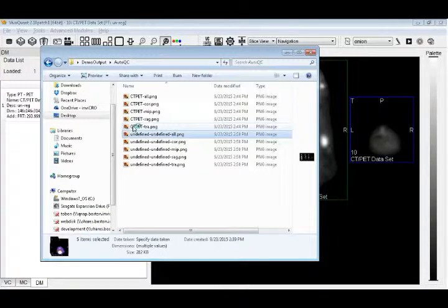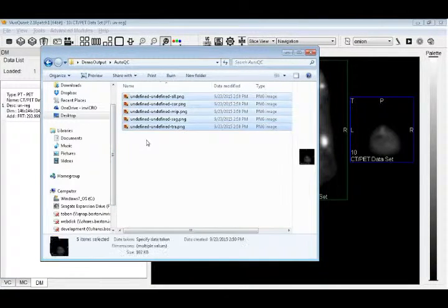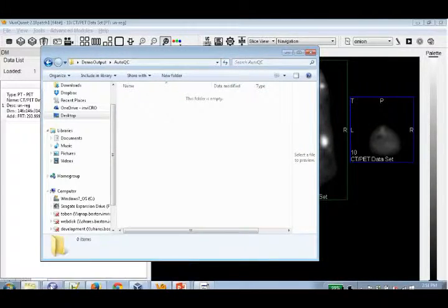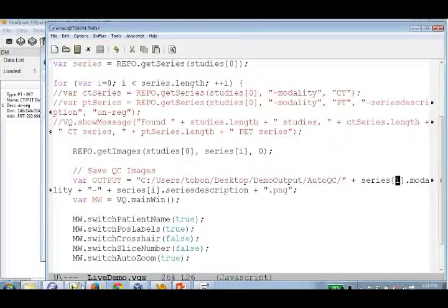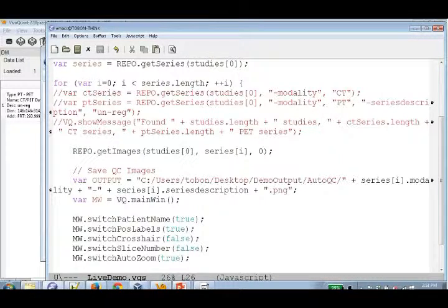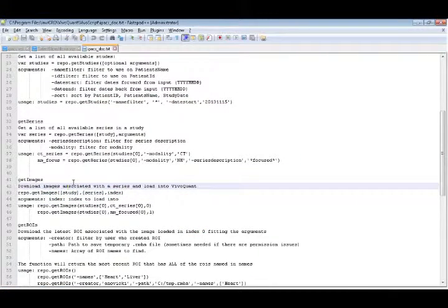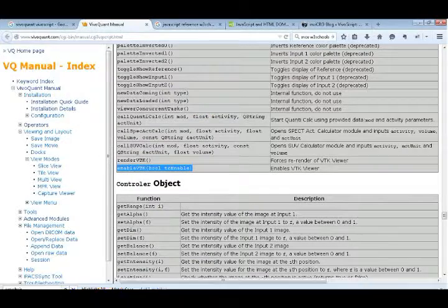Those are our old ones. Let me trash those so they don't confuse us. And now I'll trash these. And so what was wrong with my names over here? Maybe the capitalization. The nice thing is if you're familiar with debuggers, you can use that in 2.5 very easily. So I believe it's the capitalization, but let me check here in one of my documentation.